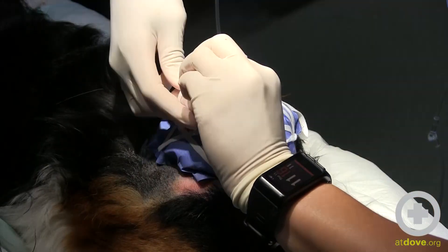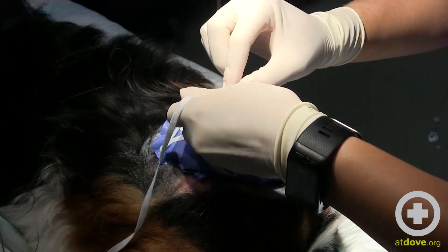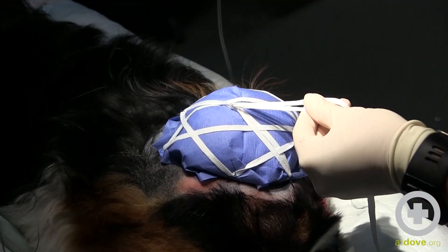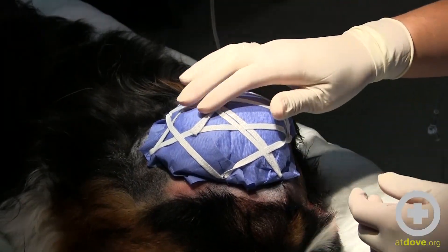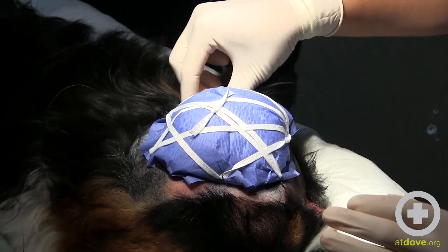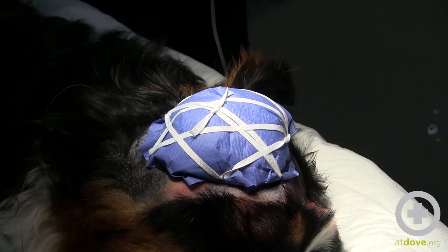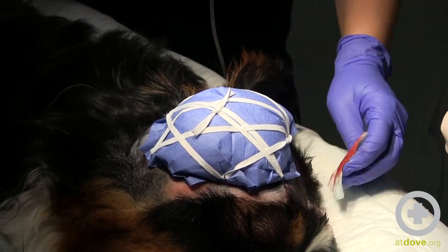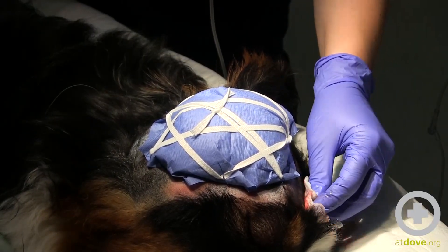I'm pretty happy with that. You can just tie this off in a double knot and cut your ends. It feels pretty secure. This is a little irritating to her, and she may want to shake her head given how close her ear is. We will put an e-collar on her, and this is short term — we just need her to tolerate it until we feel like it's healing appropriately. There is a chance that after several bandage changes, we'll feel good about how it looks and may even do a primary closure or a delayed secondary closure. But it's a wait-and-see game, and the wound will tell us what it needs.